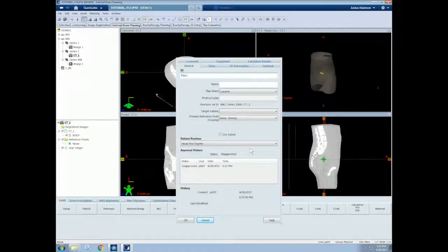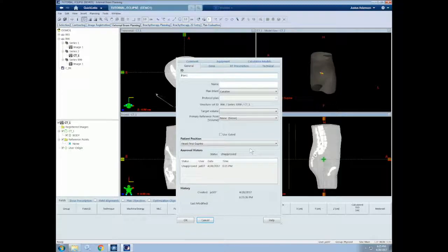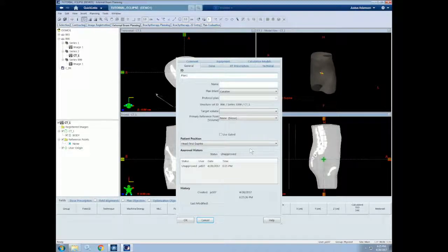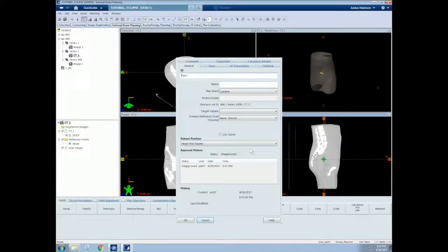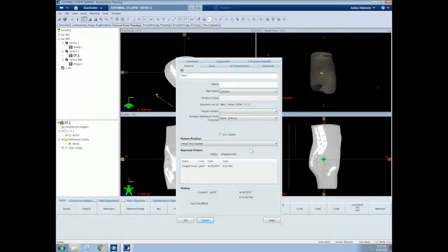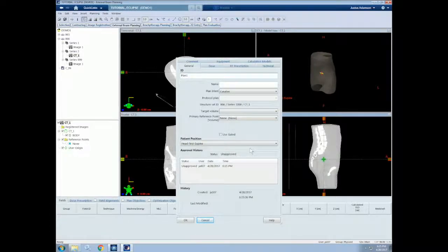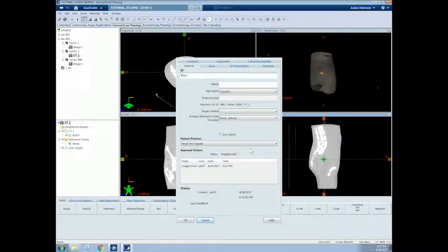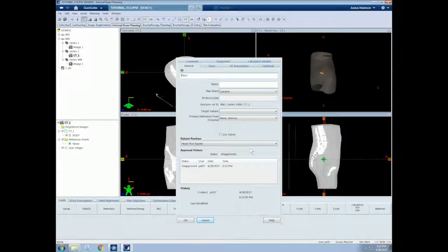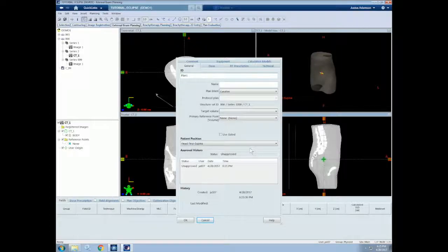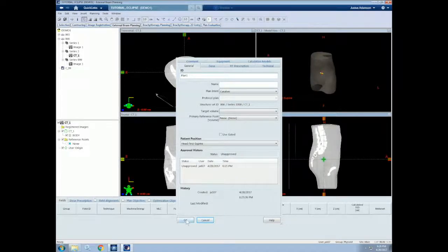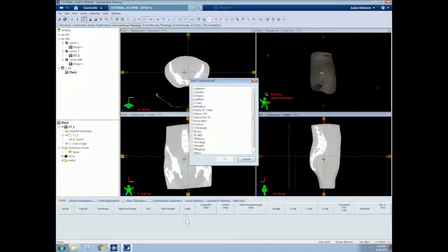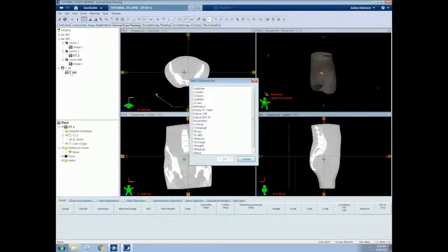Lastly, we can input various plan parameters such as the plan ID, which is the name associated with the plan that will come up on the left side of the screen and when searching for a plan, the plan intent, and some of the options we already decided on in previous steps, such as the target volume, reference point, and patient positioning. Also, we can input and view dose information, prescription information, technical information about the plan such as DICOM info, calculation models being used, any plan comments, and if there's any equipment associated with the plan using these various tabs at the top. So we can then select OK, and our plan is inserted. Plan 1.